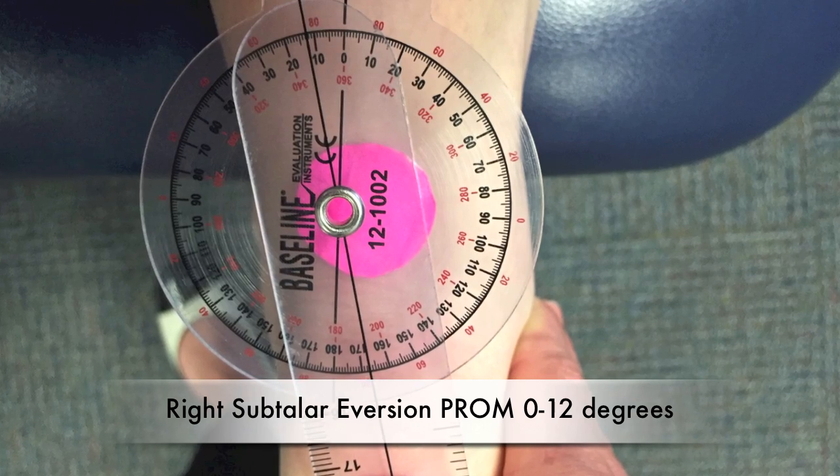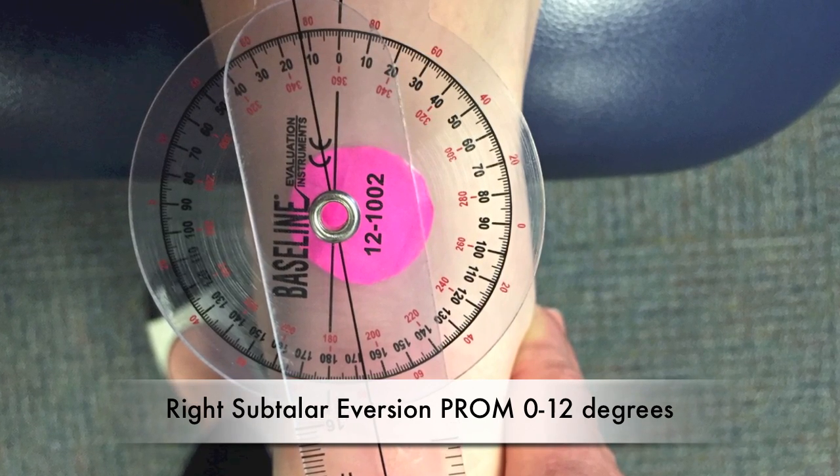Right subtalar eversion passive range of motion: 0 to 12 degrees.